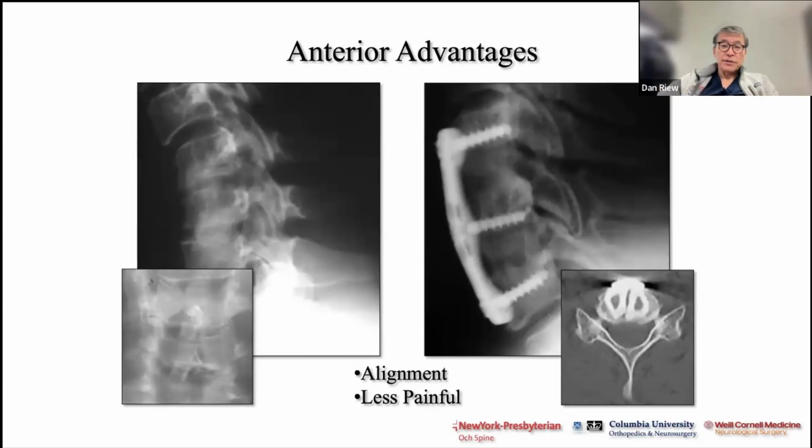When you treat it anteriorly, again, you can treat a non-union. This happened to be a non-union. You can see the little grafts that the surgeon put in. On the lateral, it looks like everything is fused together and there's bridging bone, when in fact on the AP, you see the clefts here and see that they put in a tiny little graft. You can take it out, you can realign the patient and get much better alignment.